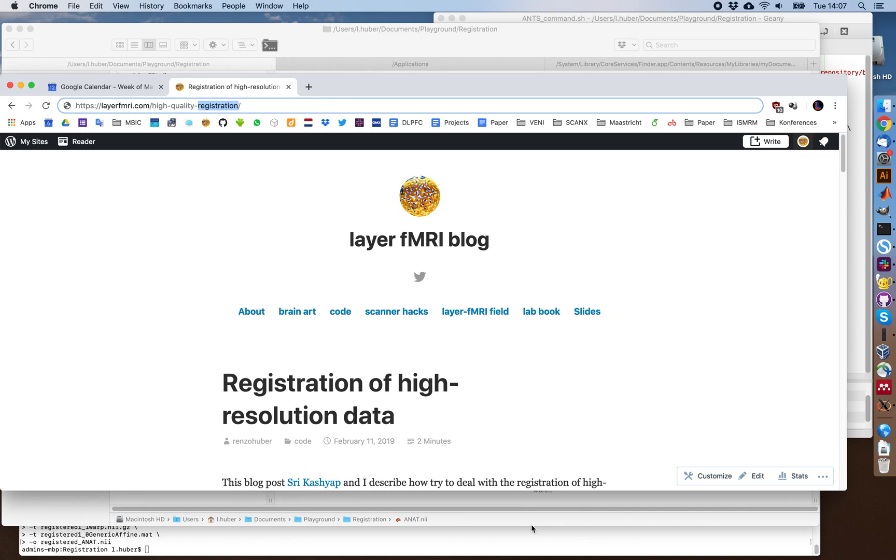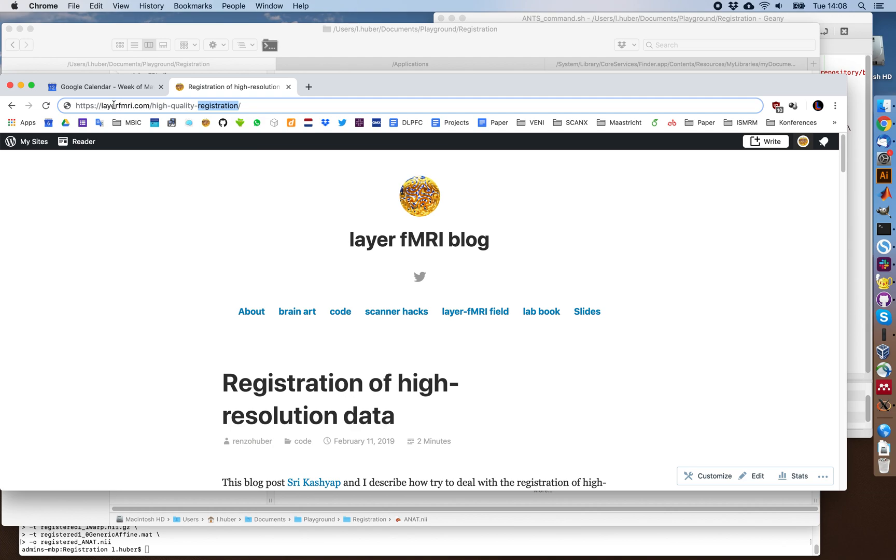I'm Huber and in this short video tutorial I want to show you how I deal with high resolution challenges of registration, specifically for layer-dependent fMRI data. This tutorial is meant as an attachment to the blog post on layerdependentfmri.com high quality registration.